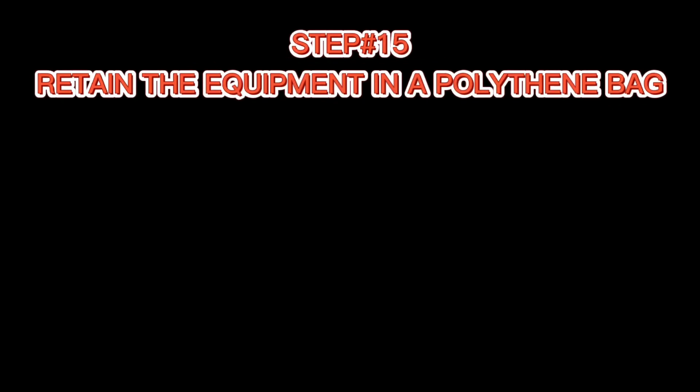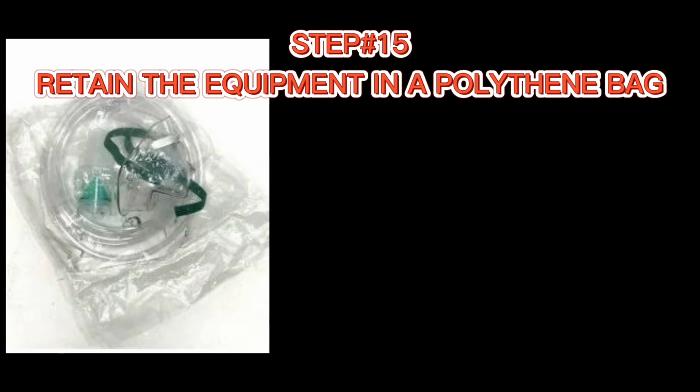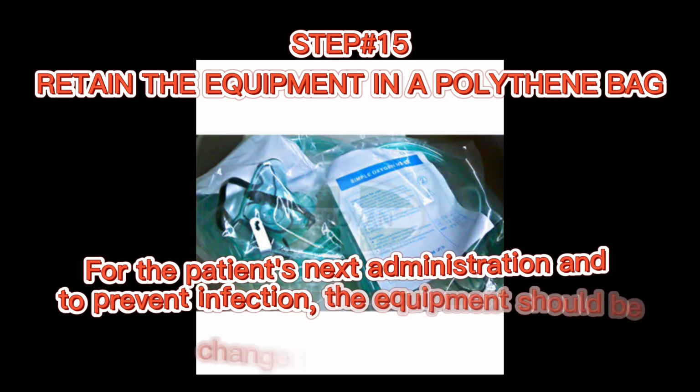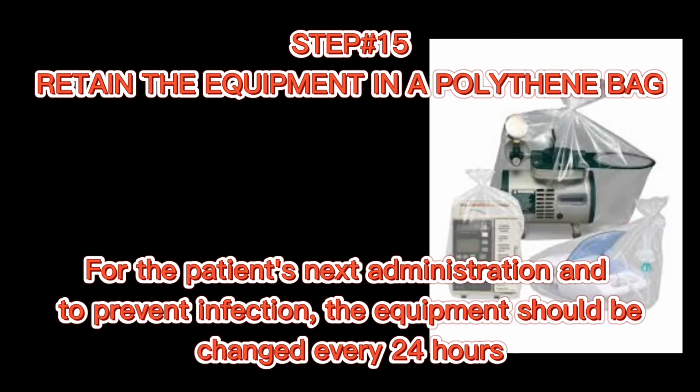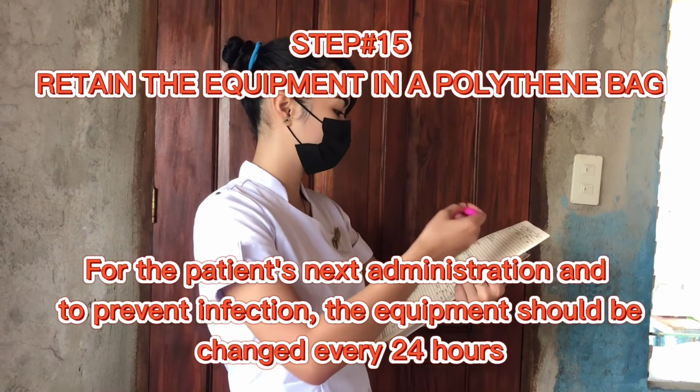Step number 15. Retain the equipment in a polythene bag. For the patient's next administration and to prevent infection, the equipment should be changed every 24 hours.